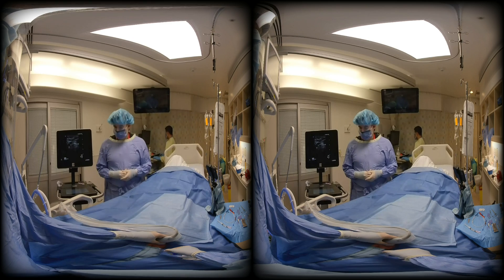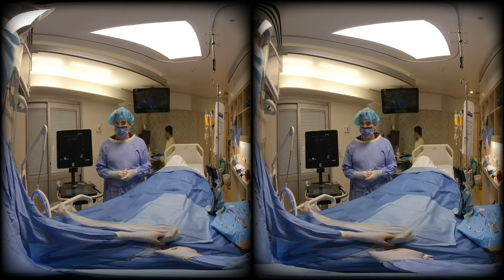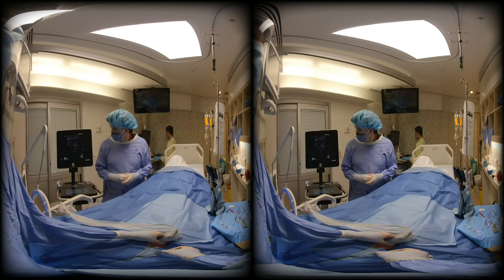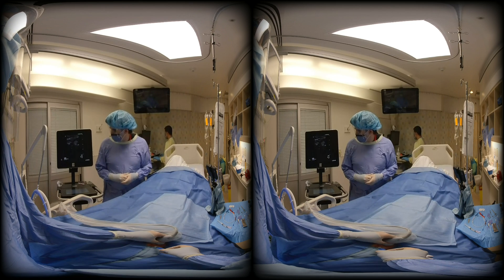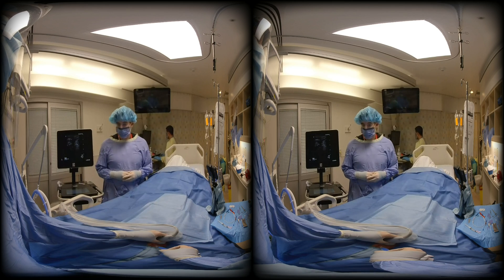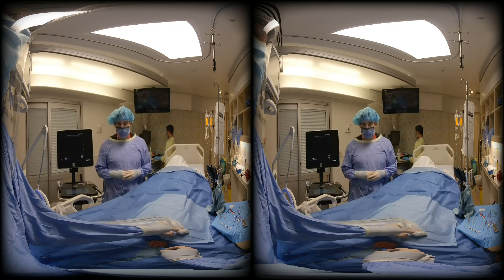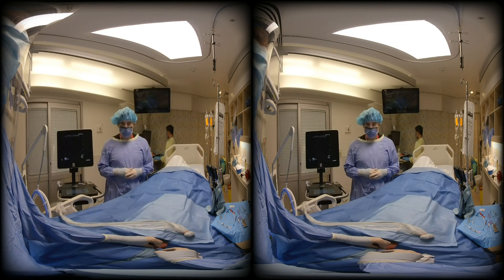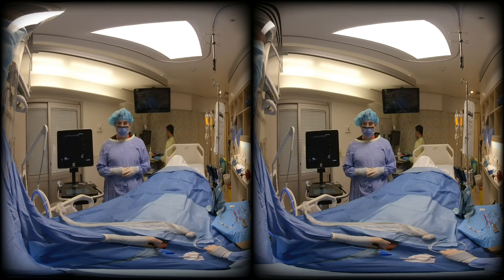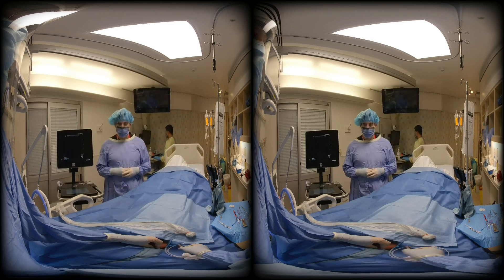Again, be sure the orientation marker is correct. As you enter at about 45 degrees, you will be simultaneously pushing and aspirating with the needle to make sure that you don't pass into a vessel unbeknownst to you. You will use the creep technique to make sure that your probe is in advance of the needle tip. Make sure the ultrasound probe is in advance of the needle tip, and aspirate to make sure that you detect a venous flash.